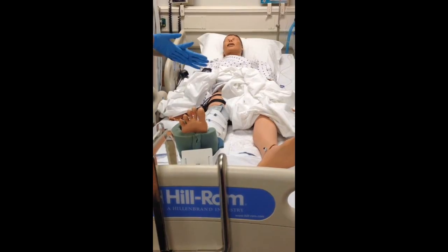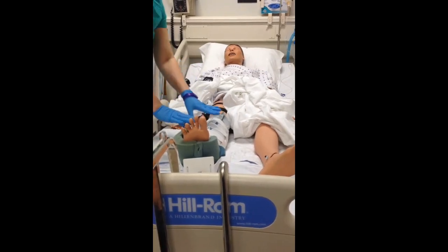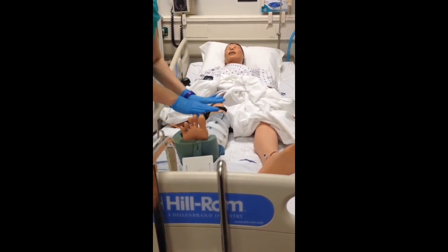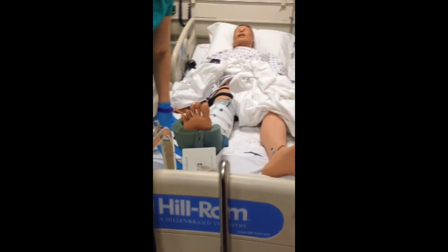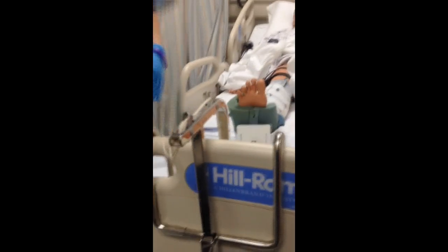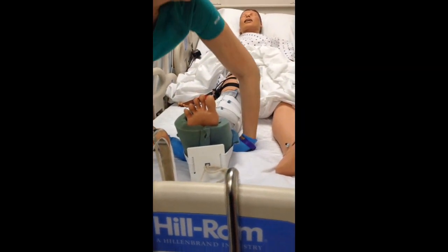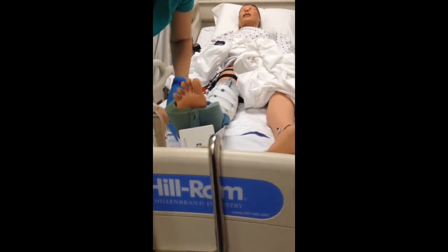Now I'm going to check for pressure. We remove the straps every four hours or per physician order. But every eight hours we remove the boot and wash your leg, dry it really well, and then reapply the boot. Right now I'm going to check for pressure. We'll put the weight on the bed so that when we unstrap it, it doesn't pull the boot off, and then I'm going to delicately remove the boot, just trying to maintain the position.